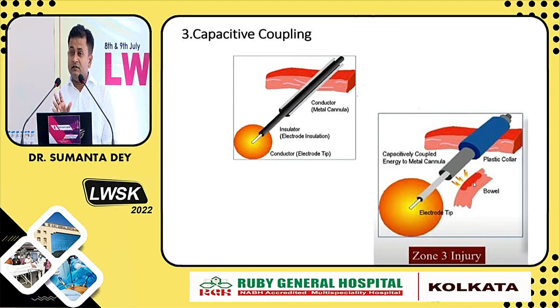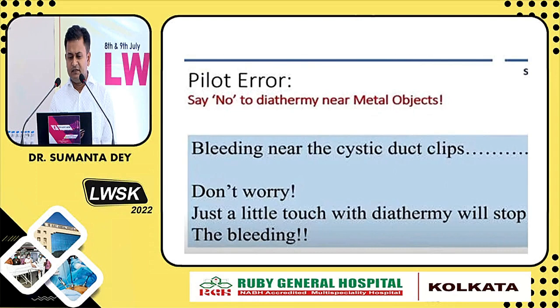You also get these as MCQs in your competitive exams. So you have to be very clear about what is capacitive coupling, conductive coupling and direct coupling. Capacitive coupling is now less common, because we are not using any plastic cannula nowadays. We try to avoid this.